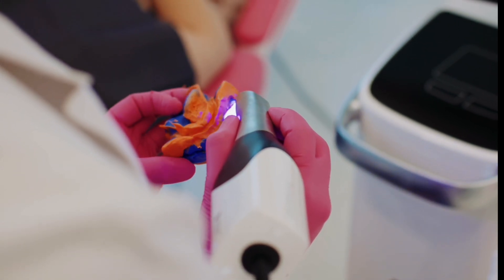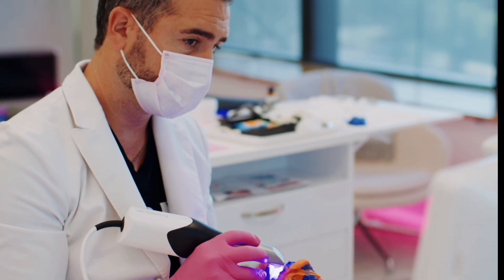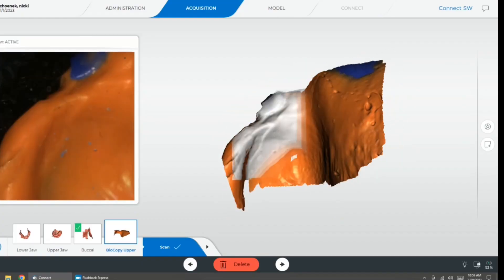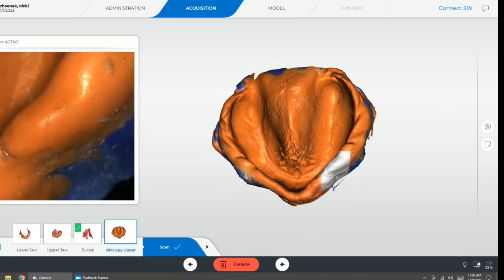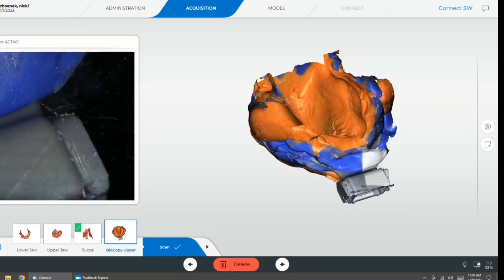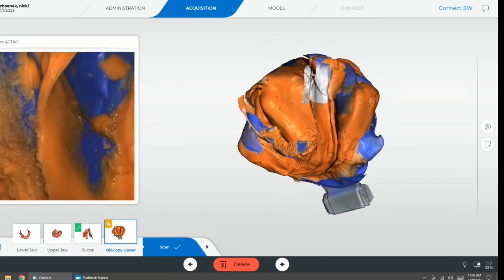And then we remove that whole thing from the mouth and scan it circumferentially using your optical scanner of choice — here we're using the PrimeScan. It's important when you scan this to make sure to capture the entire tray. Here, this is the maxillary arch index, and the anterior portion of the tray is captured along with the mandibular index.